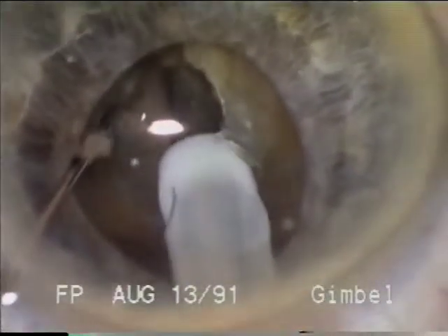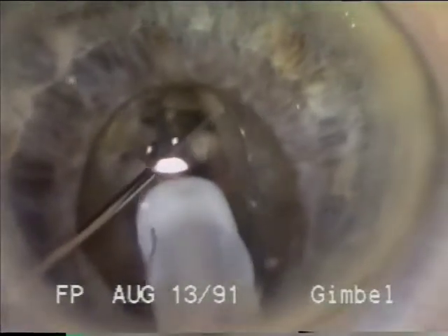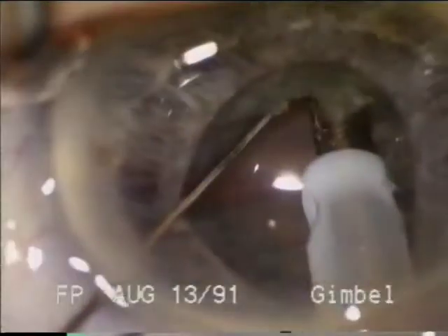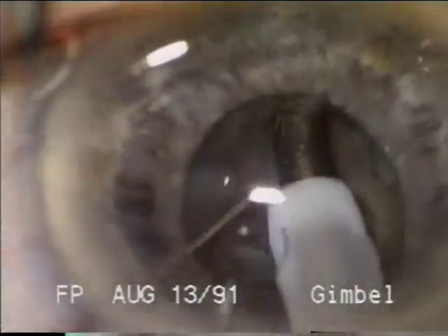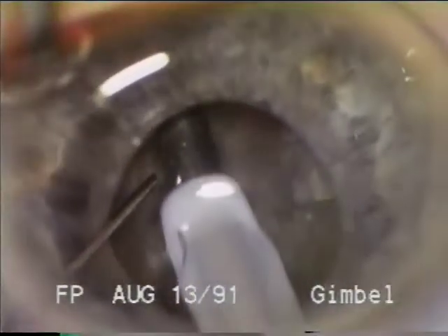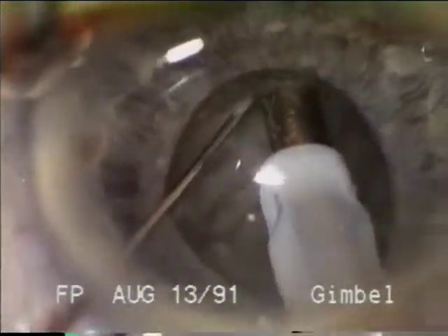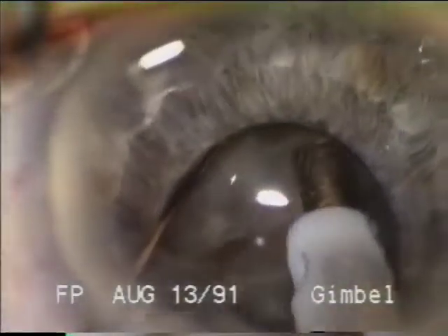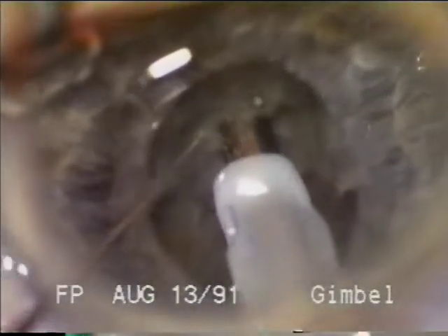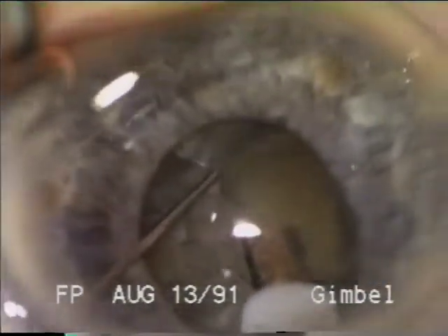Now we will accomplish the fracturing here using a cross-action technique because this nucleus is quite dense. On SFET footage we will see the two instruments causing this fracture with little distortion of the capsular bag. The lens is rotated and additional fracturing accomplished, sometimes requiring additional sculpting to maintain depth in the lens. The fracturing is facilitated by deep sculpting in the central part of the lens. If there is a nuclear plate left in the center of the lens posteriorly, the fracturing does not easily extend to the posterior pole. The fragments were left in place to maintain the capsular bag and the stability of the nucleus to facilitate the fracturing.